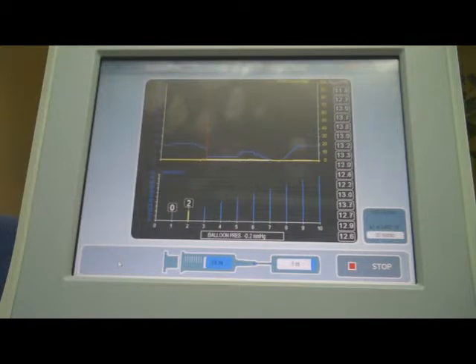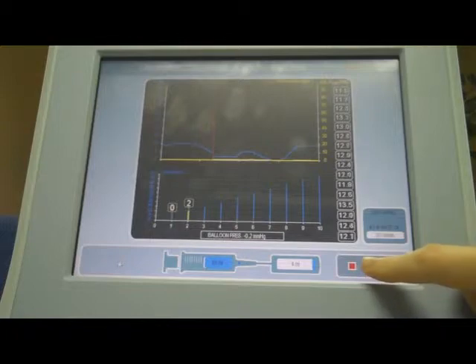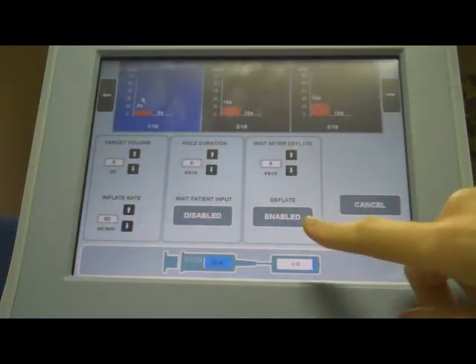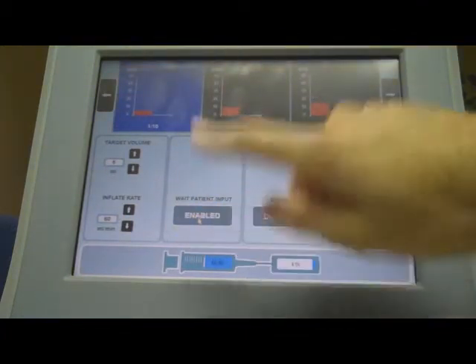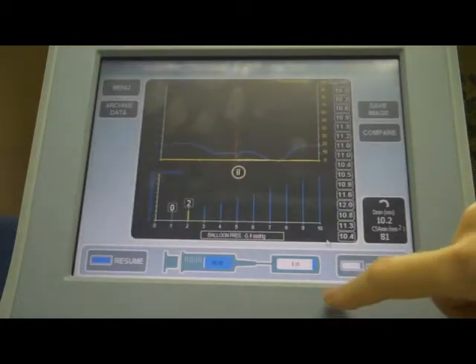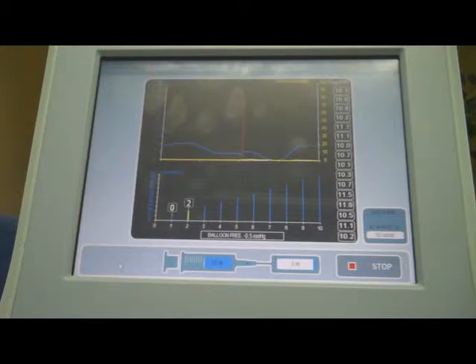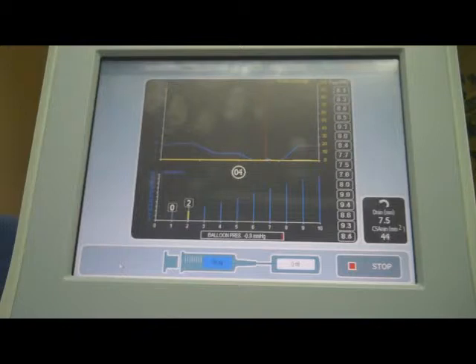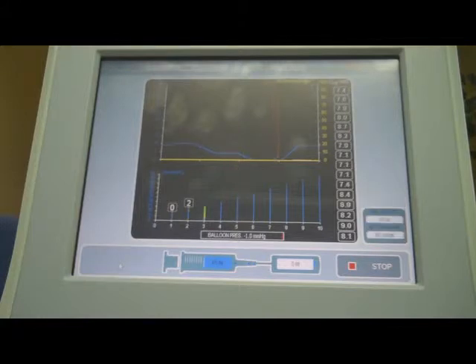If partway through the procedure you want to change the settings, you can do so. Press the stop button, then menu, then configure Baristat, and make your changes. For example, let's say we want to stop deflating and instead select wait for patient input — we can do that. Then press resume.